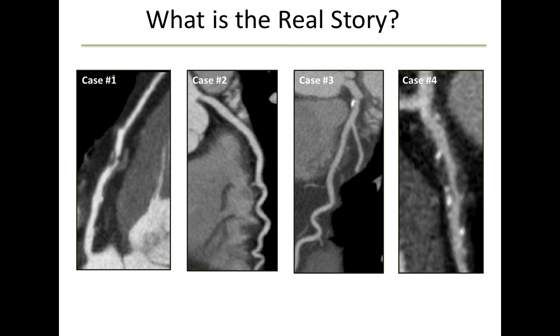And I would posit to you that these patients have not only very different imaging findings, but a very different downstream clinical risk and should be treated very differently. And CT uniquely identifies these imaging phenotypes that really inform downstream clinical decision-making. Why do I think CT should really be the first-line test?